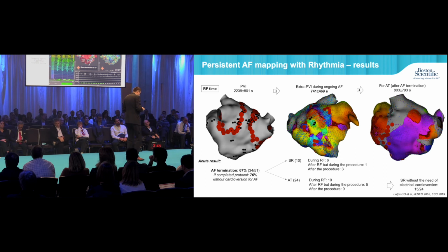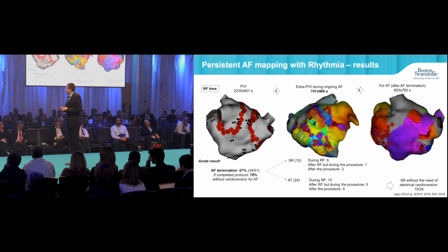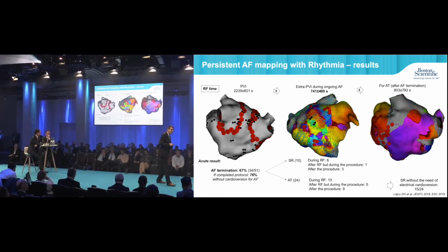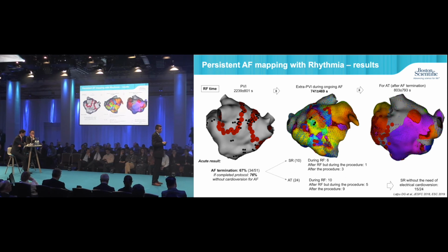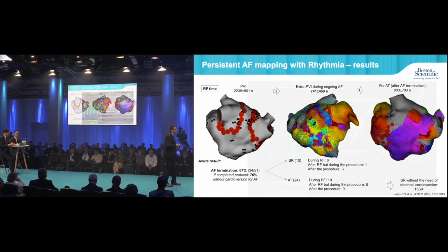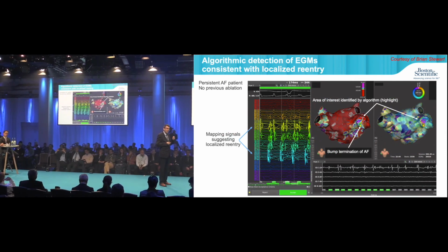We are now closing the follow-up for these patients, and up to now, the results are very, very encouraging. If some of you are still concerned about the reproducibility of the technique, what I want to tell you is that for 1.5 years now, we are working with the Research and Development Department in Boston Scientific in order to develop an algorithmic detection of these sites to be targeted with the ablation.